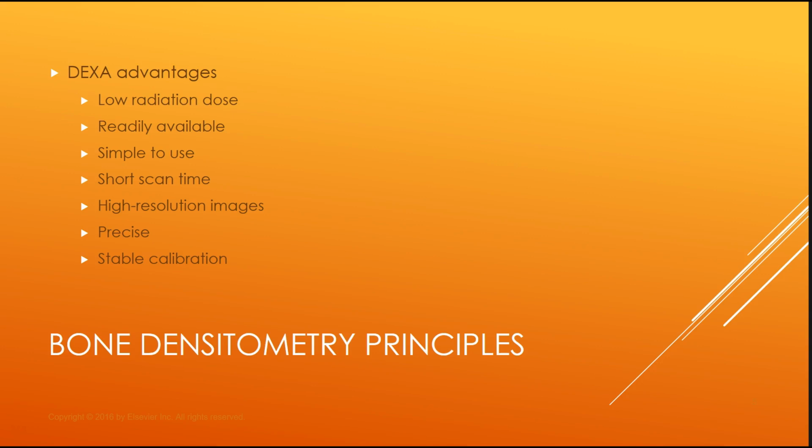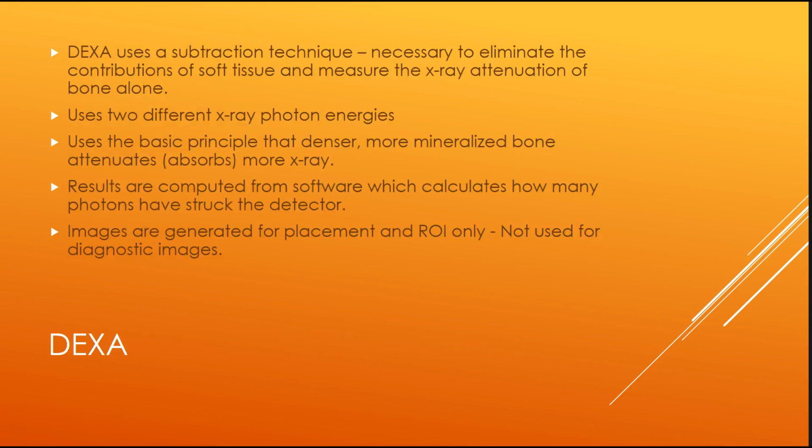They are precise if the patient is positioned correctly. That is of utmost importance in DEXA, patient positioning. And lastly, make sure that the calibration is current and correct.